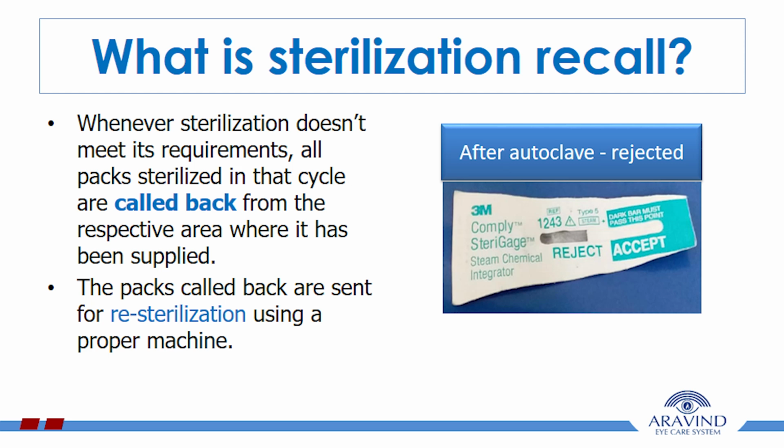Check for proper labeling of date, time, number of bins and bundles, name of the autoclave, load number, and name of the sterilizing person. Check whether the bin holes are locked properly during unloading.